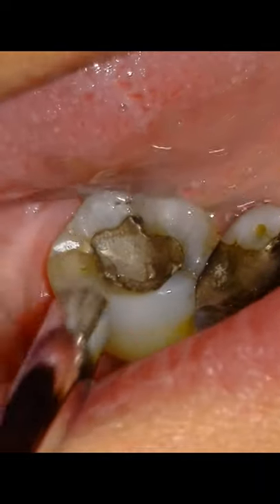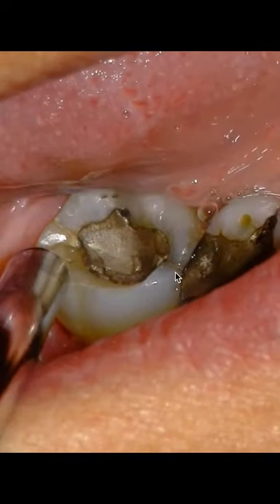Why would you not root canal this tooth? Well, let's take a look real quick. We've got a mesial fracture, we've got a distal fracture. The unicorn that stands out to me is a small occlusal restoration. And we've got furcation. So is this a fracture necrosis? Probably yes.